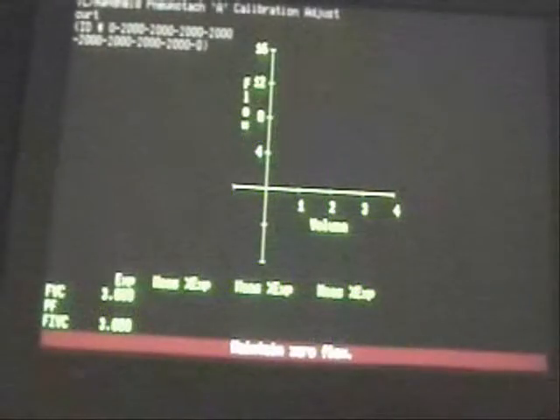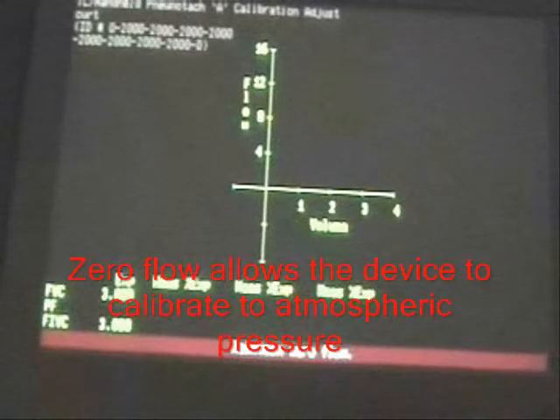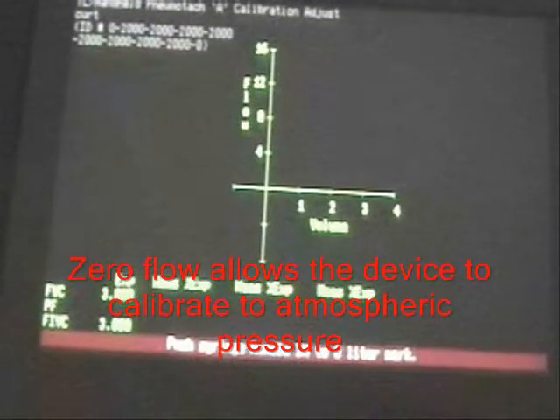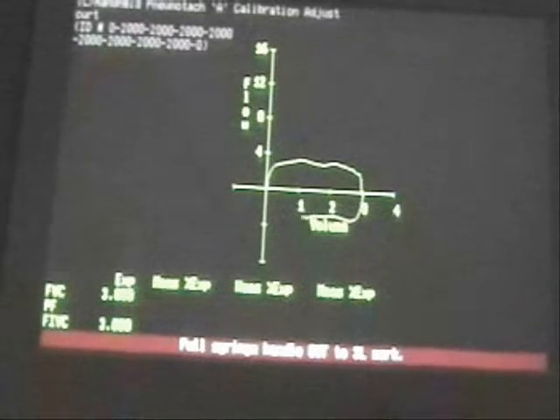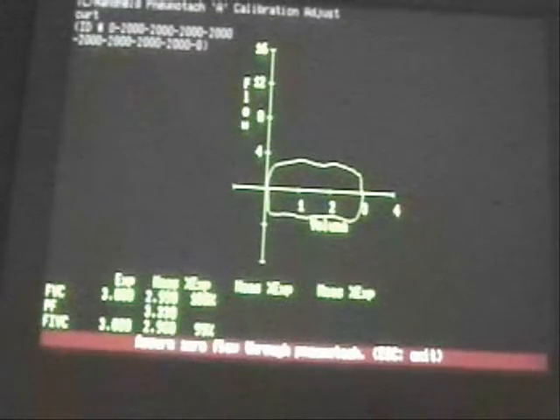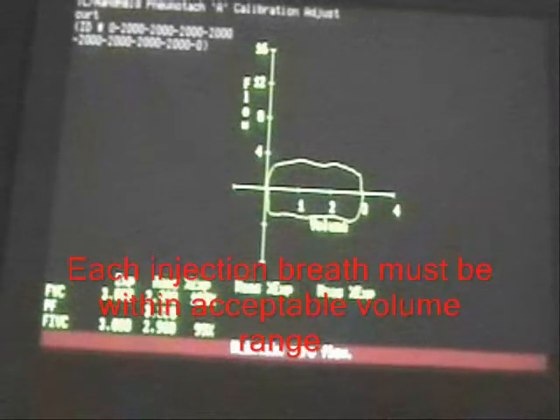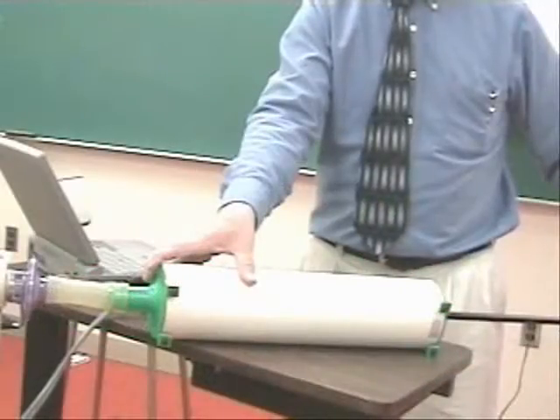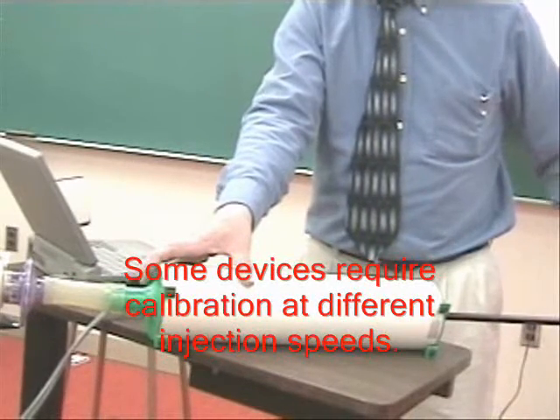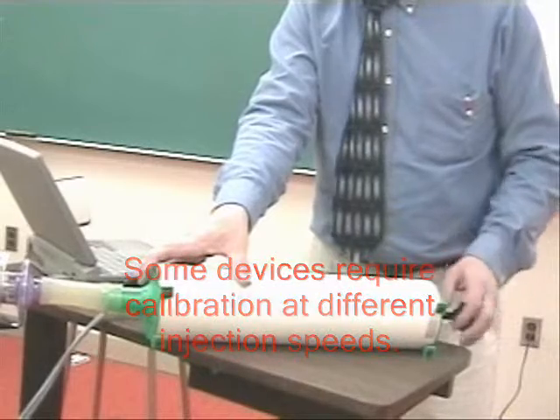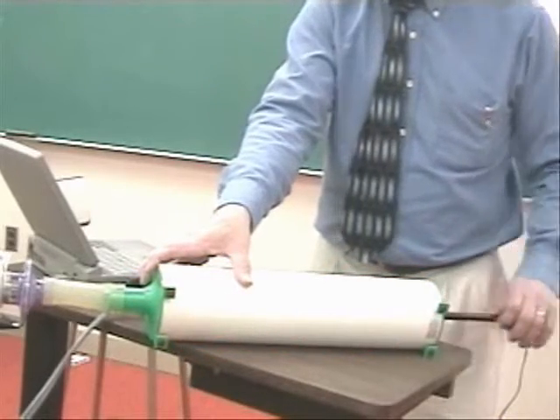Now we don't want to move it. It says maintain zero flow. Push in syringe to zero, pull out to the 3 liter. Do not move, maintain zero flow, no movement on the syringe. Push in the syringe handle to zero, and pull out.